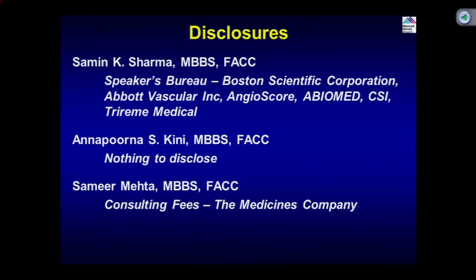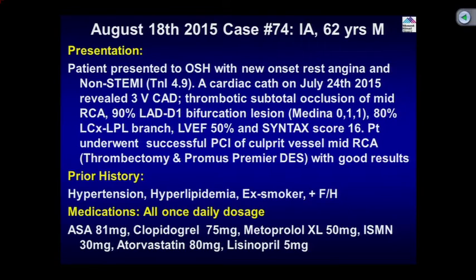These are our disclosures. Nothing has changed. This is a 62-year-old male. It's a little different type of case which we are presenting today. It's not our usual one, stable angina.